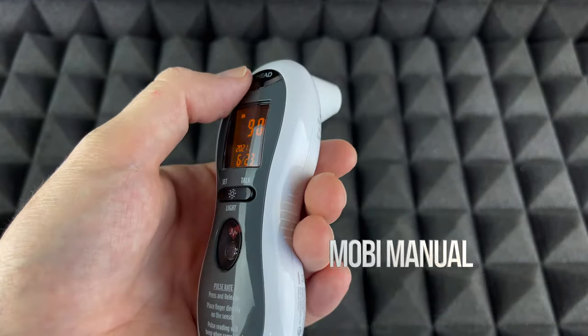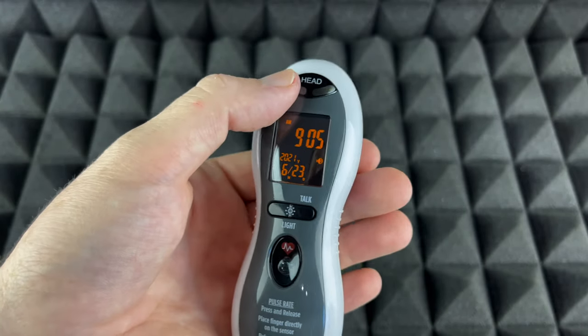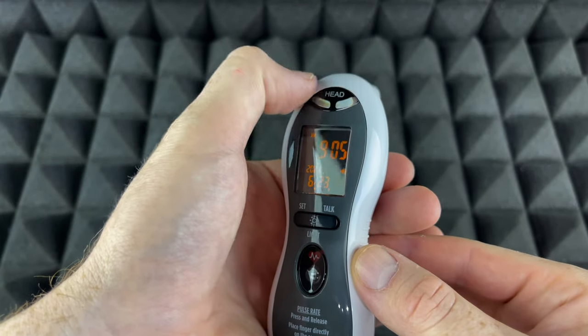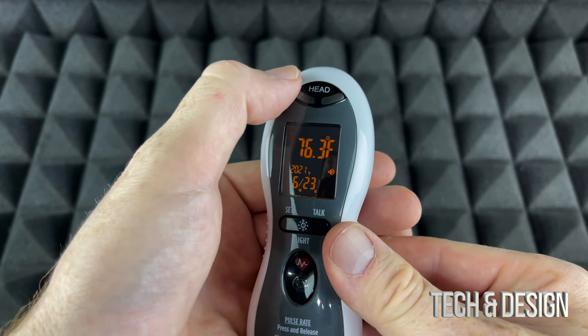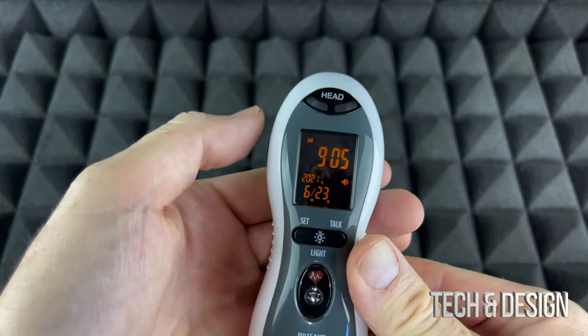If you would like to change this from Fahrenheit to Celsius or Celsius to Fahrenheit, just press right up here. This is the scan button up here. Right now it's Fahrenheit — and now it's Celsius.